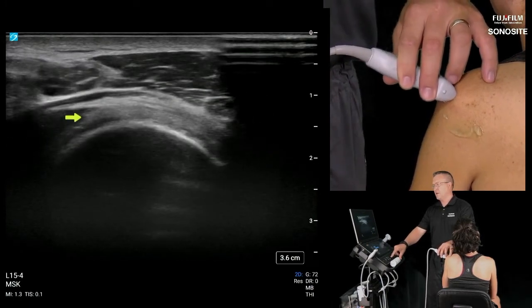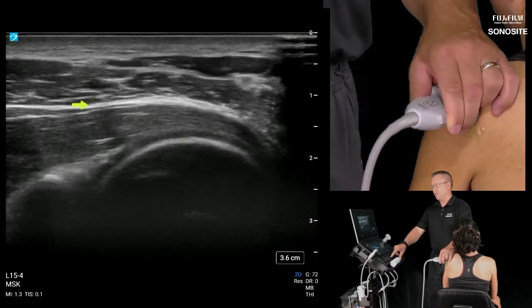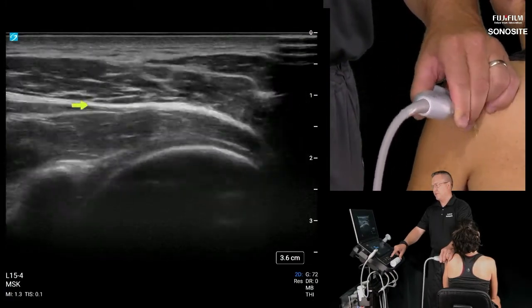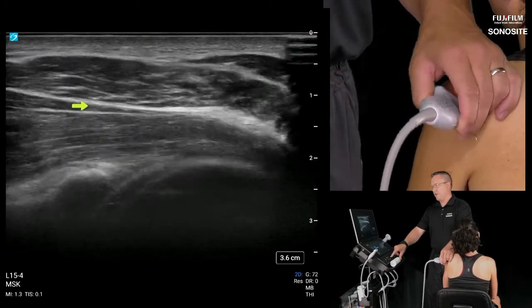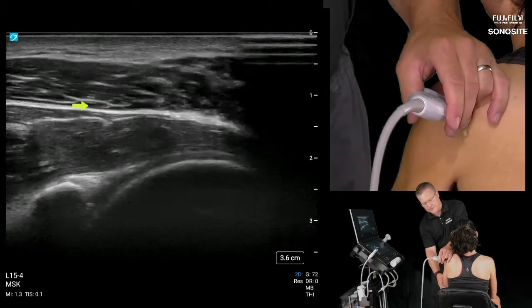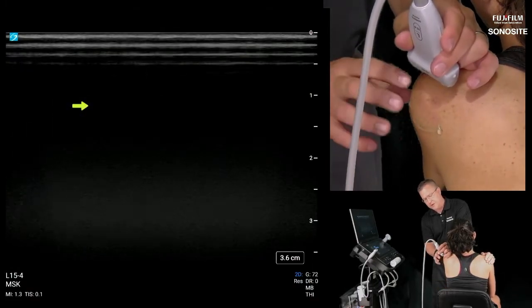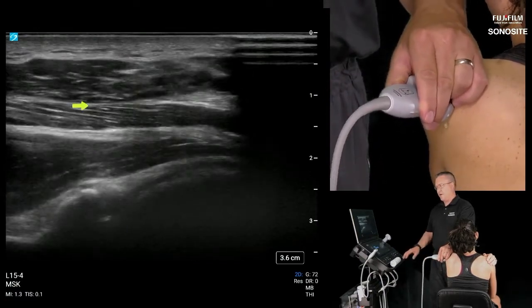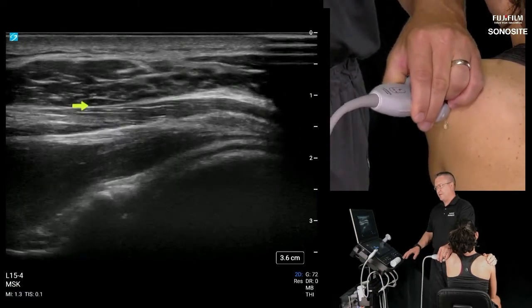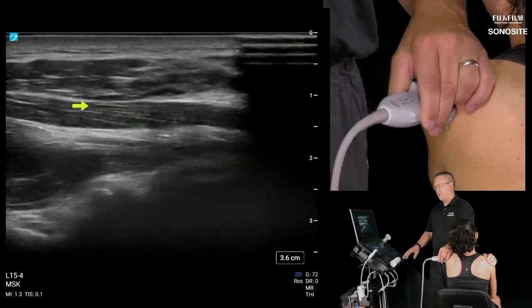Now let's follow the infraspinatus central tendon posteriorly until it's laying over the joint here. I don't see it laying over the joint very well, which is okay. Sometimes you can just have the patient grab their opposite shoulder, and that will cause the infraspinatus and the humeral head to inferiorly drop. So there I do see that central tendon really nicely, and it makes it easier to evaluate the long axis of the infraspinatus tendon.